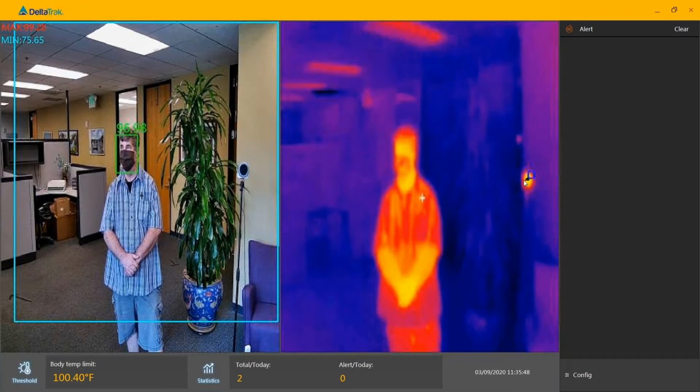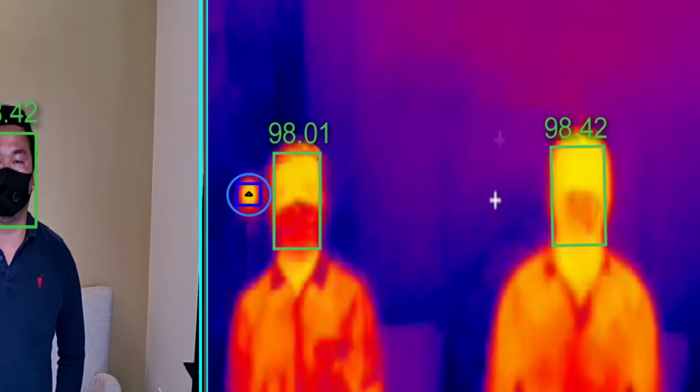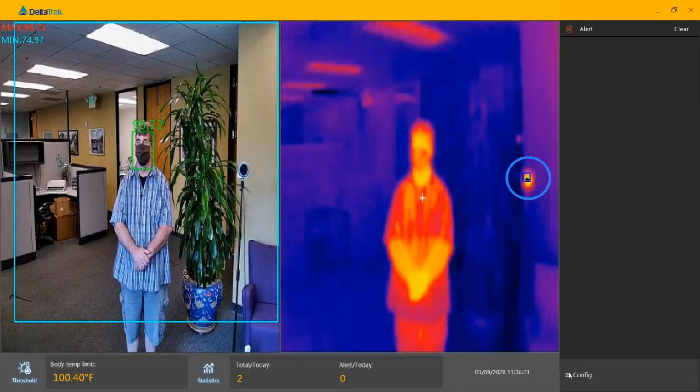First, we will identify the blackbody. The blackbody is the heat radiating device we are referencing, identified as a triangle in the thermal imaging view window. With the cursor, draw a small square around the blackbody triangle.